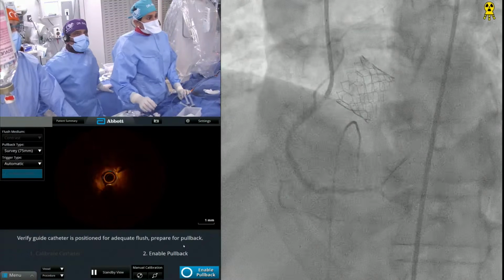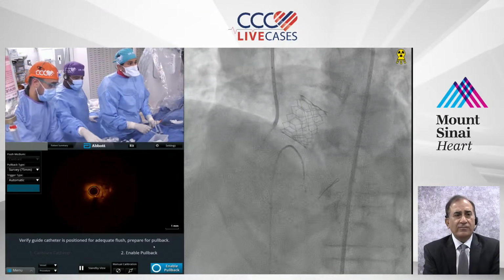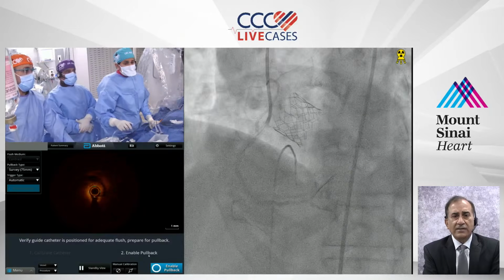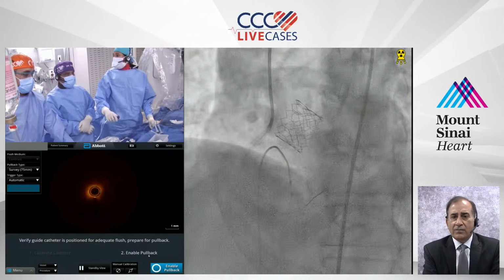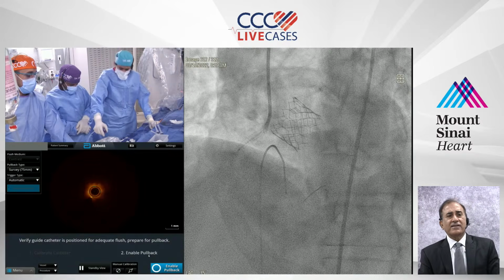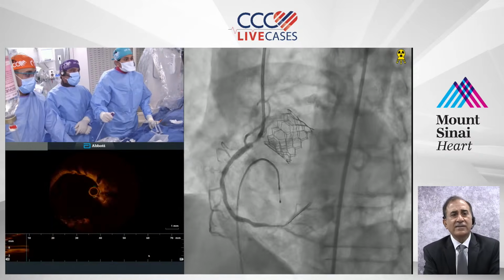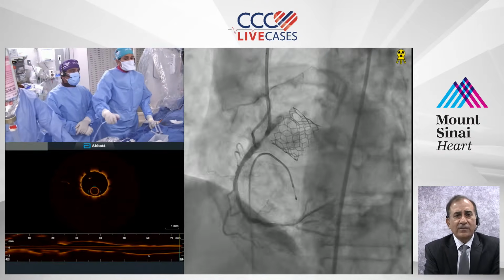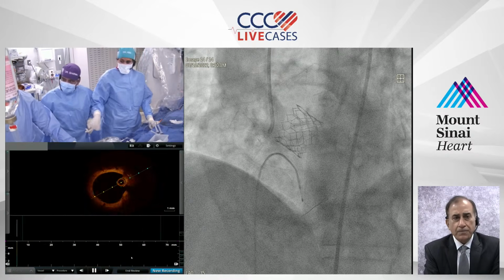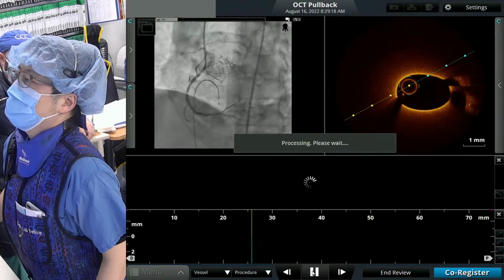Great. So let us assume that there is a modest amount of plaque underneath the stent. Would it be an absolute contraindication to even consider IVL in the absence of calcification, but knowing the fact that there is a residual significant plaque? Great image. Yeah, so very good point. I think that's an excellent point. Can you do full screen OCT?